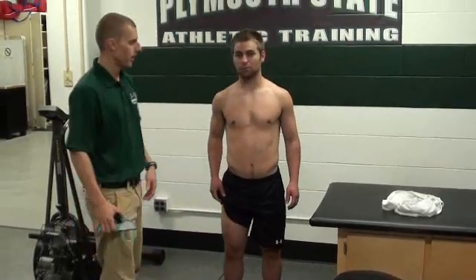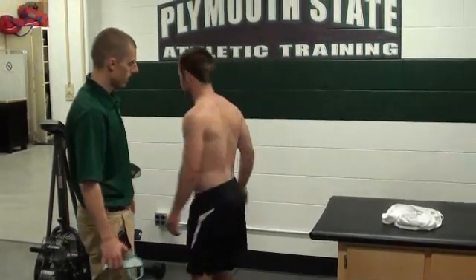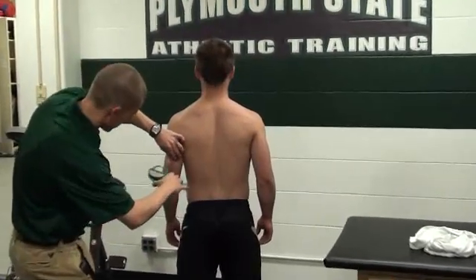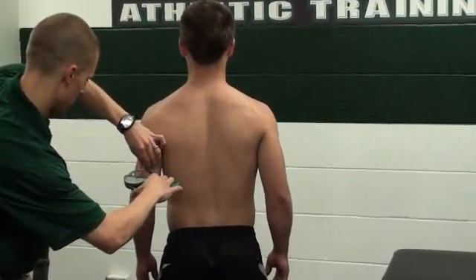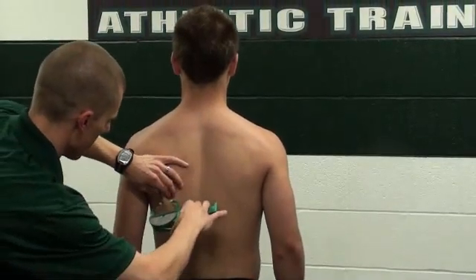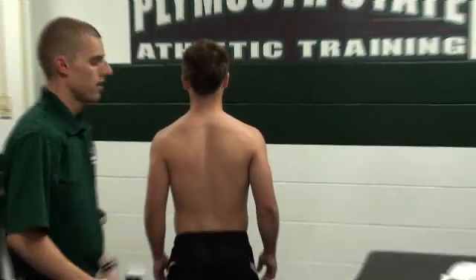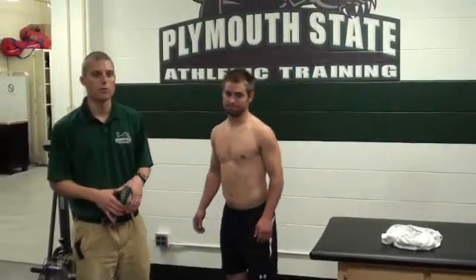We record those three sites, then rotate around. On the back we do the tricep. We record those and plug them into an equation to get the percent body fat.